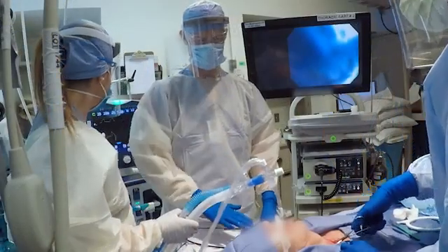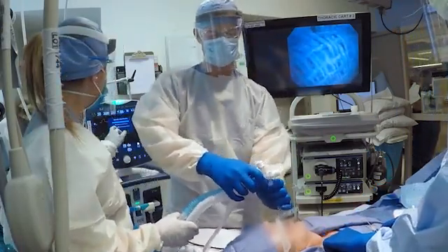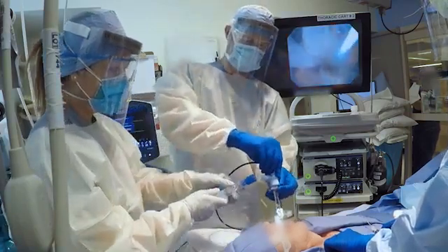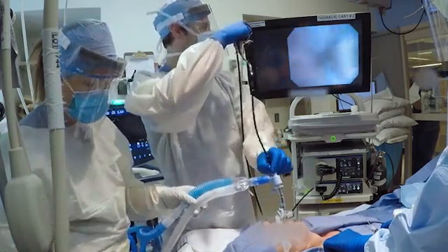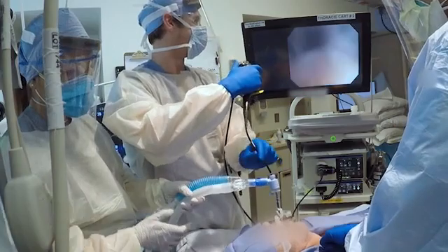Next, ask the respiratory therapist to induce apnea by placing the ventilator on standby. Then, disconnect the oral endotracheal tube from the ventilator circuit and attach a bronchoscope adapter to the oral endotracheal tube. Insert the bronchoscope into the adapter, reconnect the circuit, and resume ventilation. Advance the bronchoscope into the airway. Briefly survey the trachea and clear any obstructing secretions.